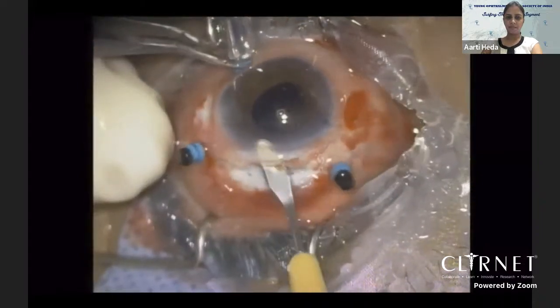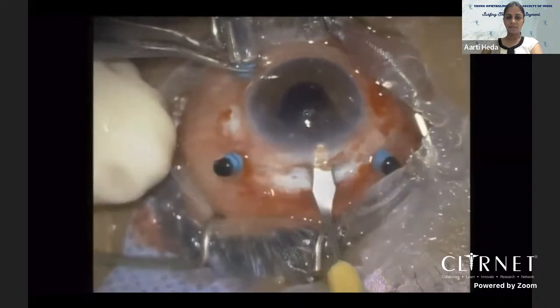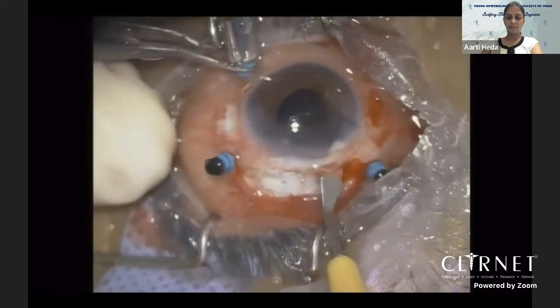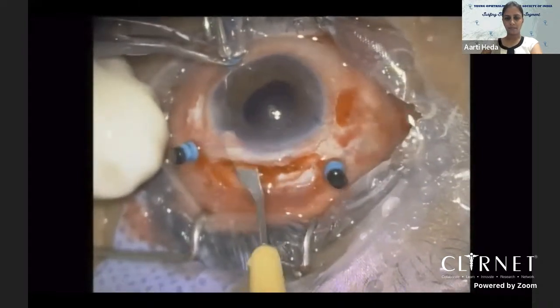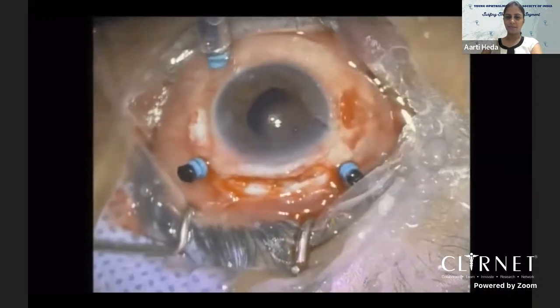So this patient had a scleral tunnel made before. So here I'm just trying to open that up really carefully with the crescent blade. Again, it's really important to have a well-formed tunnel despite the challenging conditions in which these cases come to us.